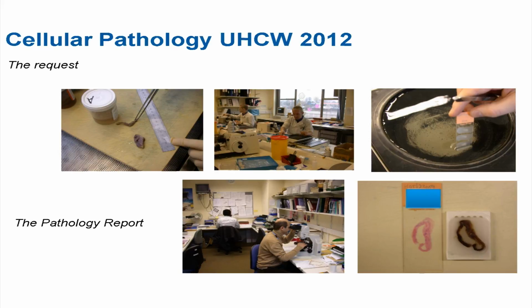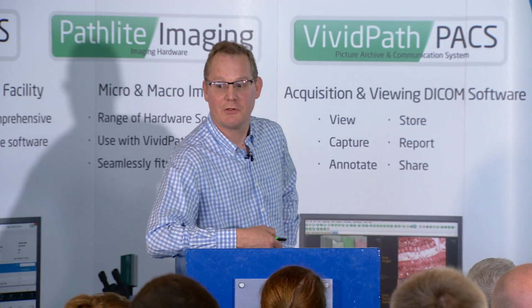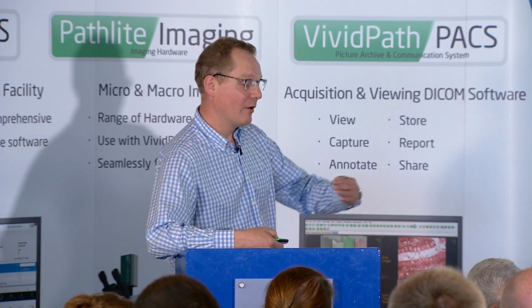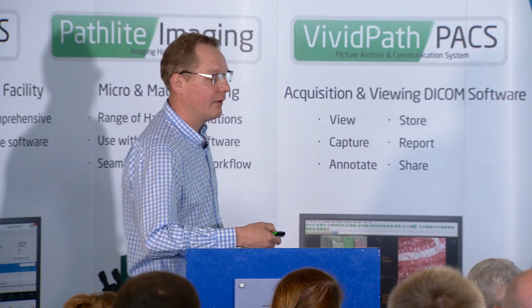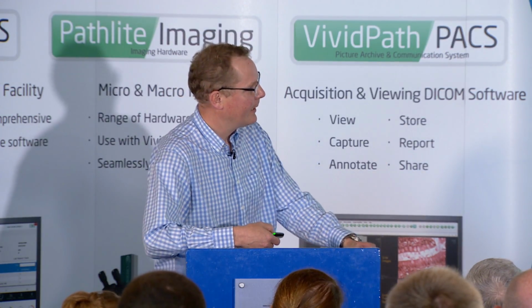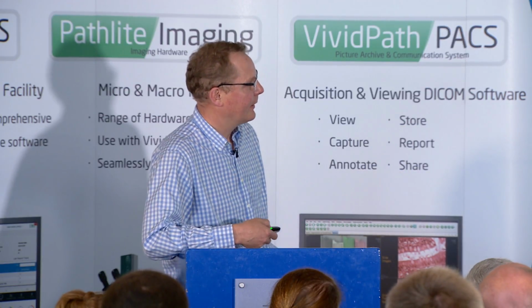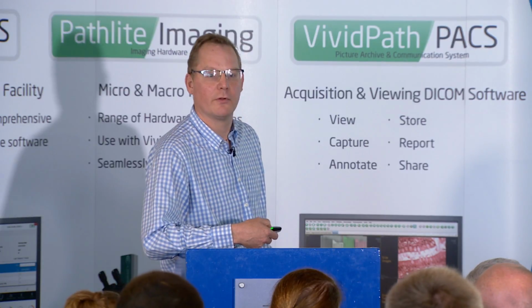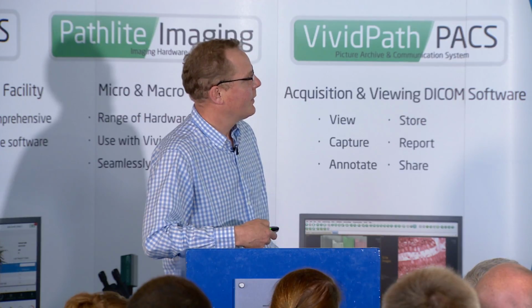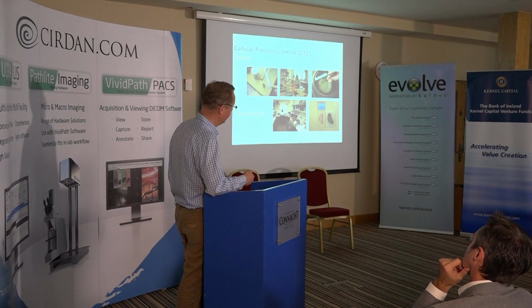I was at a meeting just before I came away here of our academic clinical fellows. These are our bright young things across the hospital who have been fast-tracked through their training program, so they're doing academic work alongside their routine training. And we'd just given our presentation on work we're doing on small cell lung cancer, and one of them asked, well, what does histopathology do? So this is what we do. We take the sample, we process it to wax, we cut sections and look at it under the microscope.